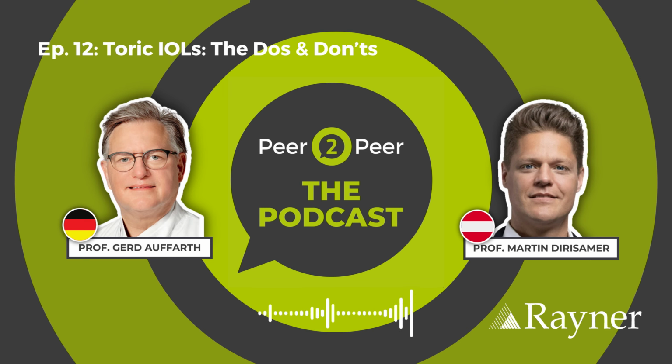I think you touch a really sensitive point, because I think it's a combination of material, design, size of the eye, and the size of the capsular bag, and so on. So a couple of things come together, and plate haptic lenses like the Zeiss lenses, for example, are very easy to handle, and if you use them on a routine basis, you get very, very nice results. I occasionally have a patient where I have the feeling the capsular bag is too big and it starts propellering, so I'm hesitant in putting it in high myopic patients.